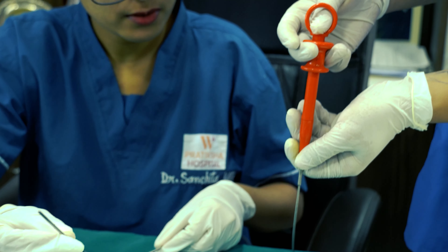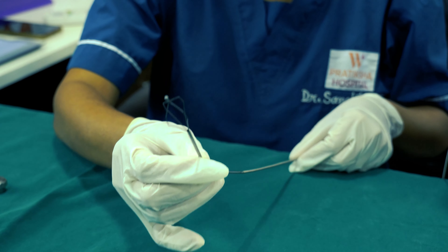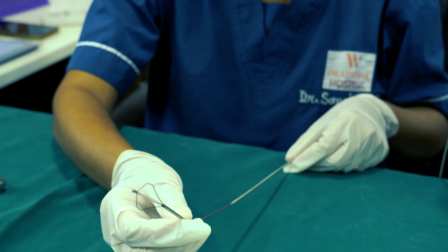We recently came across this amazing instrument — a dormia basket, as shown here. This is the distal tip. If you open it, you can see the dormia basket, and it can be used for foreign bodies which are extremely slippery and cannot be evacuated by normal forceps. Close it. Now let me show you how we can use this dormia basket with the rigid endoscope assembly — the same assembly we used initially for visualization. We will remove the suction from the suction port and introduce the dormia basket through the suction port. This is an improvisation which we were quite successful with.